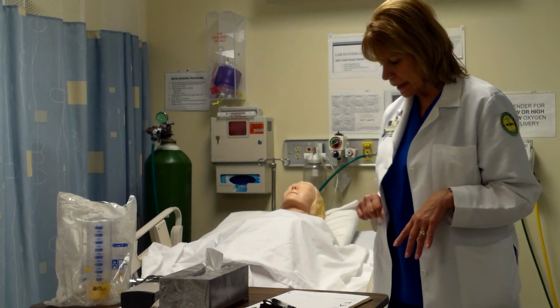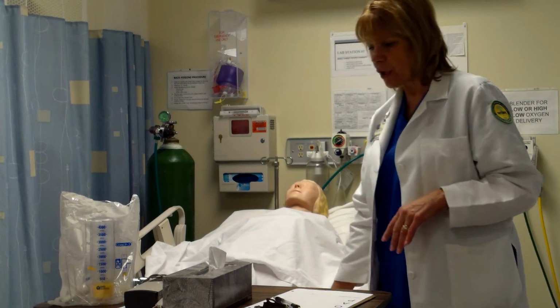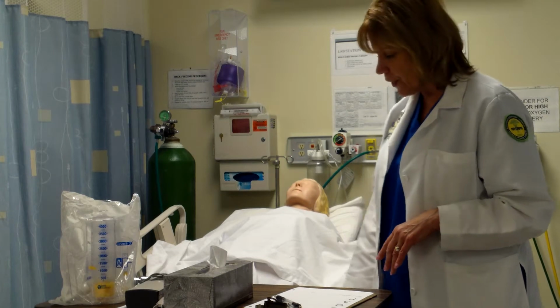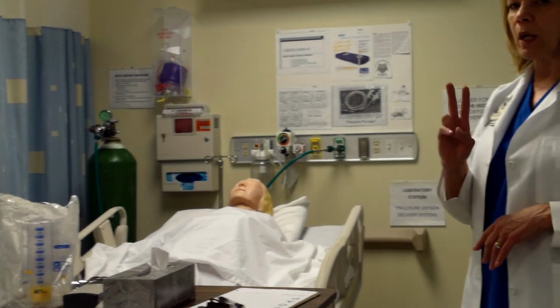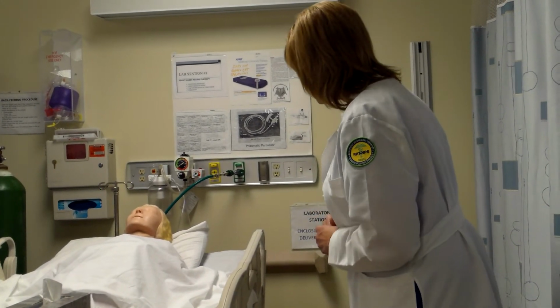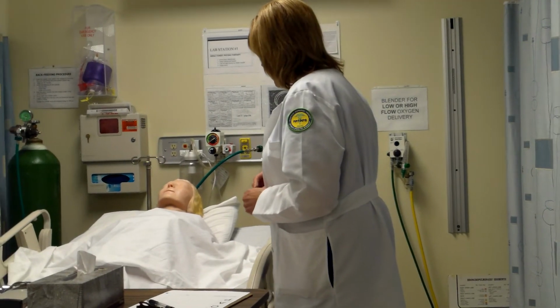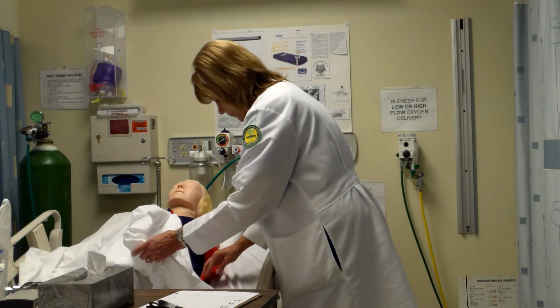the volume-oriented one, okay? So I have looked over my patient's chart, and I do have an order for volume expansion therapy. So now I'm going to come back into the room, and remember you have to have two identifiers. So I'm going to say hello, Ms. Clark. Can you tell me your full name and your date of birth? And can I see your ID bands?